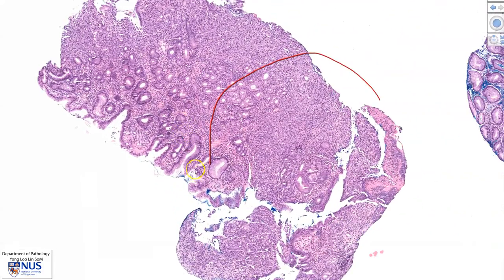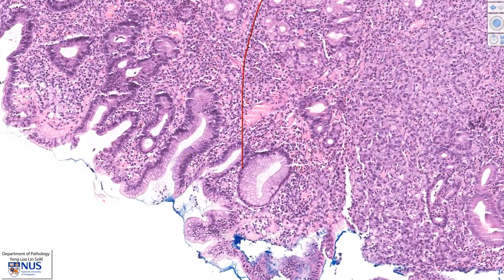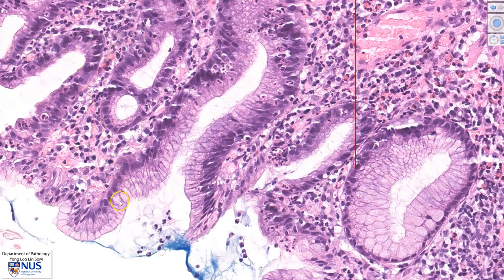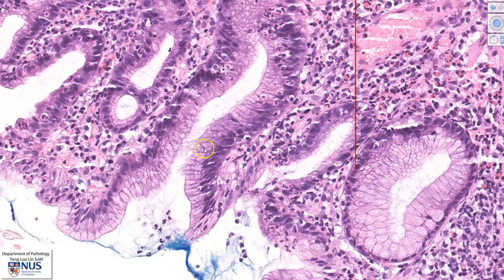Let's first take a look at the non-cancerous gastric mucosa. This is the foveolar mucosa, which is composed of columnar cells with abundant cytoplasmic mucin. We can see that the nuclei are quite uniform and polarized to the base of the cell, with all nuclei lining up at the base with abundant mucin.